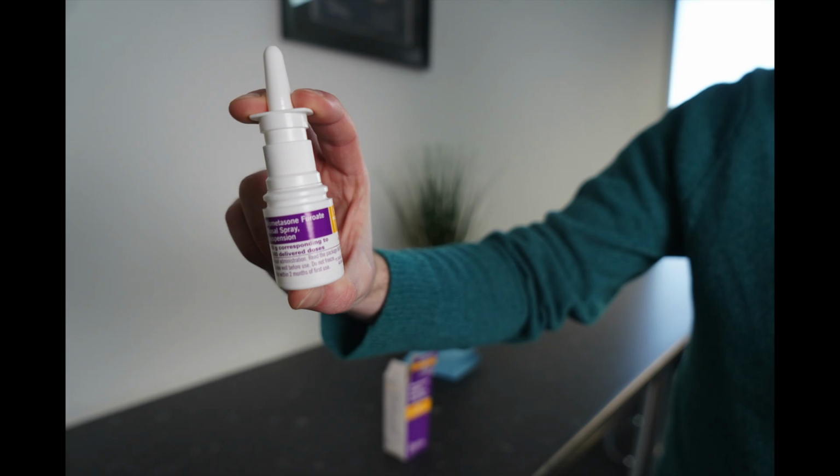Next, gently blow your nose to clear the nostrils. Put your forefinger and middle finger either side of the nozzle and your thumb underneath the bottle as demonstrated here. Close one nostril and put the nozzle into the other nostril. Tilt your head forward slightly, keeping the bottle upright.